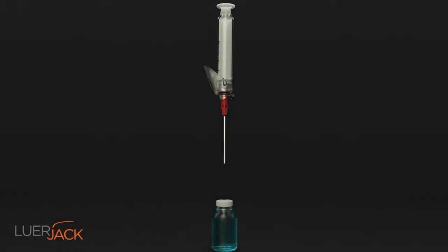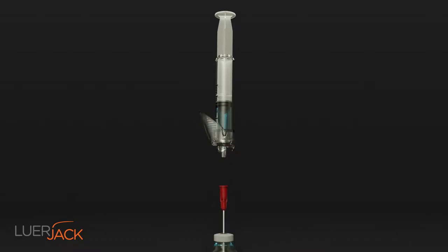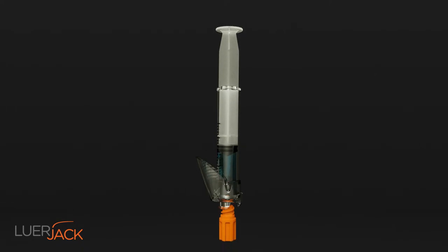The Luerjack lock hypodermic syringe is developed to improve infection control and patient safety by performing an aseptic non-touch technique. The one-handed design supports healthcare professionals to click and release without touching any key parts.